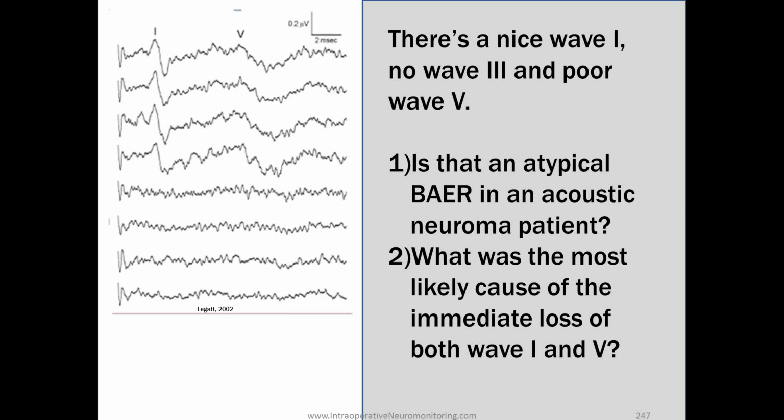So if it is technical, it could very well be that the tube could have fallen out and our stimulator is bad. Fluid could have gone in the ear, something of that sort. Those are common causes that could happen in the operating room. You know, it's not going to build up wax in an hour. That would be more towards baselines.